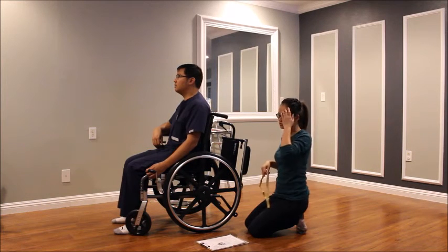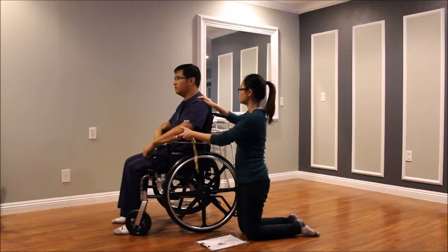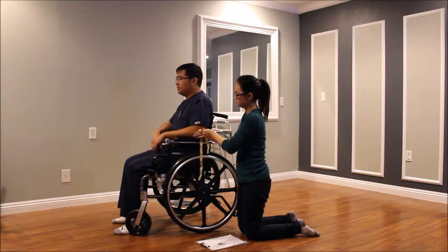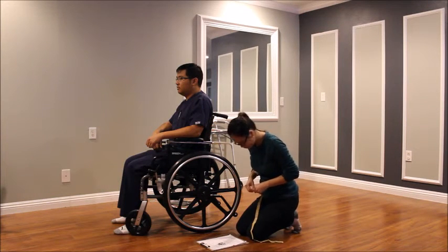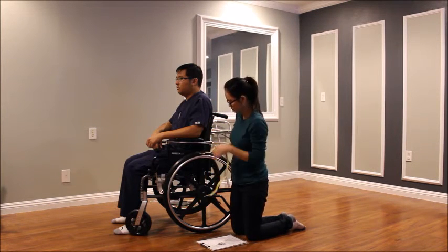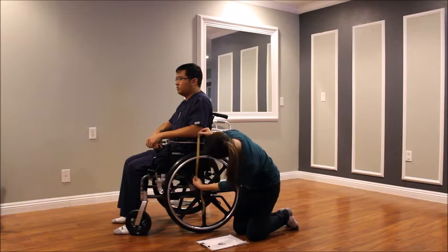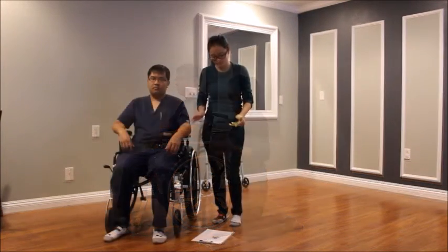And the next one that we'll look at is arm height. So you have the patient's shoulders all neutral, and you have them bent. And what you do is you measure from the bent elbow here down to the cushion seating. And that's about 12 inches.